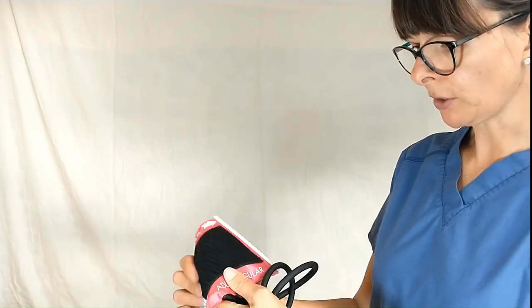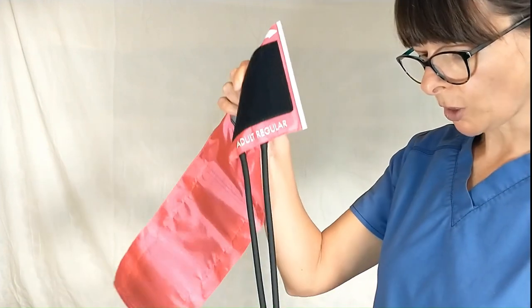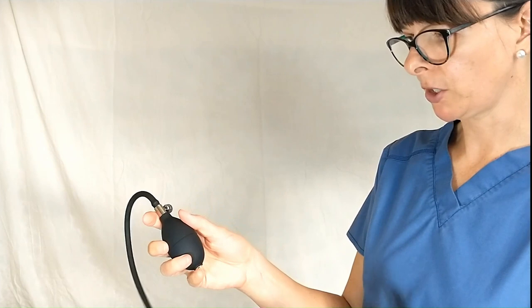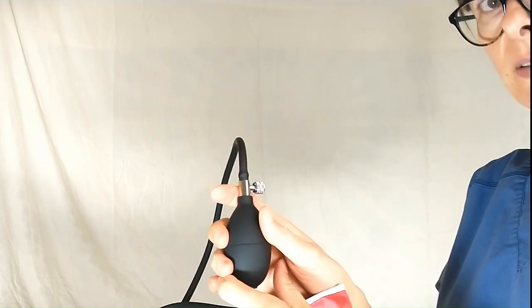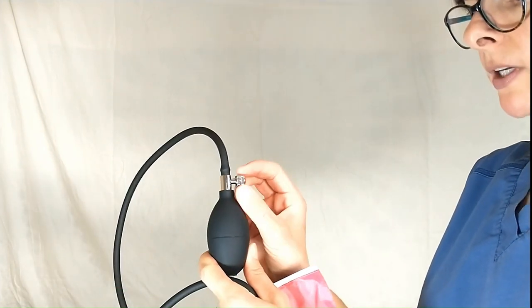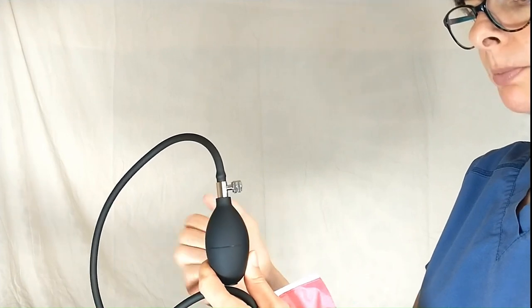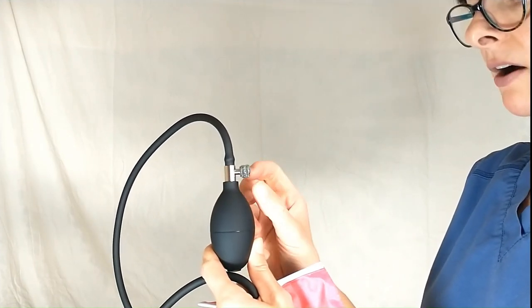Now looking at the two other compartments or parts, we have our bulb here, the one that actually inflates the blood pressure cuff. So there is the dial and then here's the bulb that we will actually squeeze to inflate the cuff.